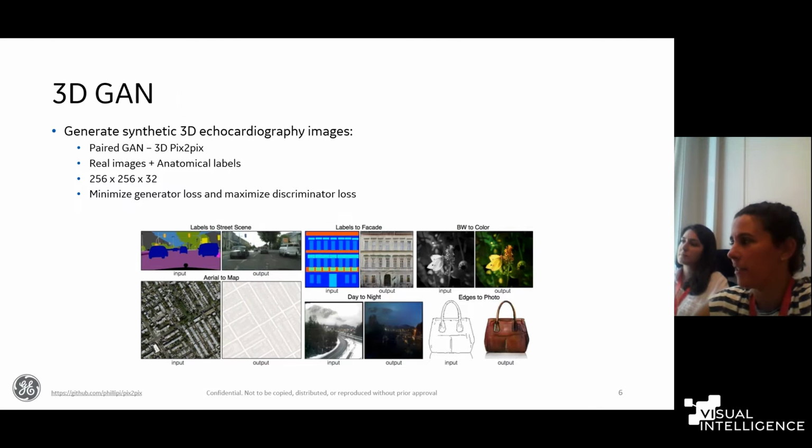I don't know if you are familiar with it or have ever heard of it, but the GAN that I'm using is the pix2pix model. So this is a paired GAN. Like I mentioned, the images on both training domains are related. And what I've been doing is I took the original work, which is the one you can see here on this figure.